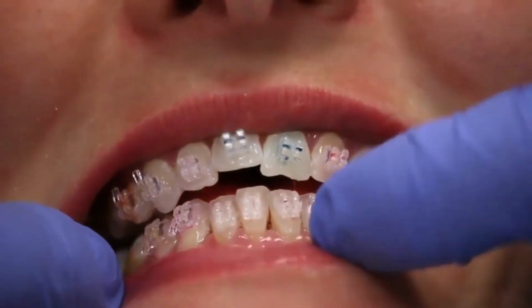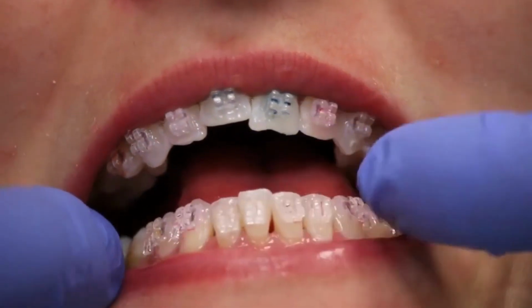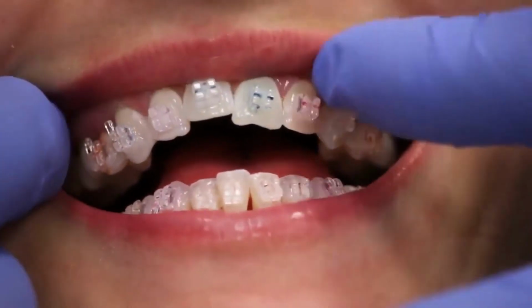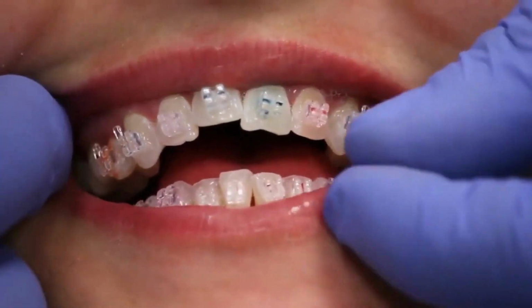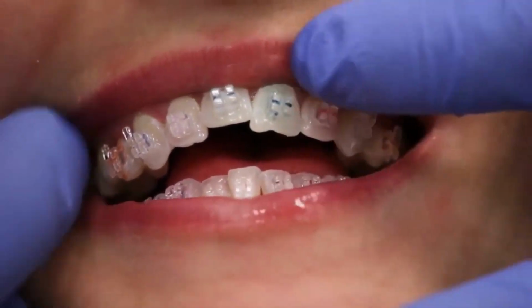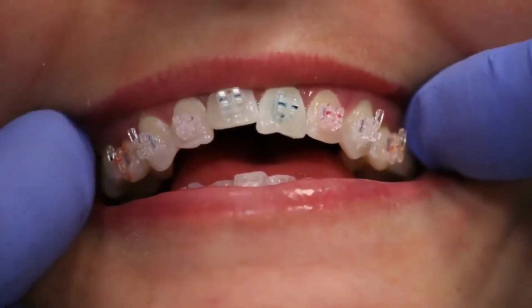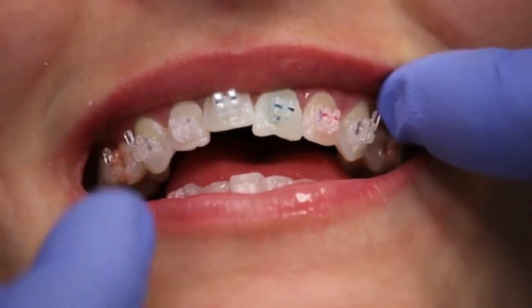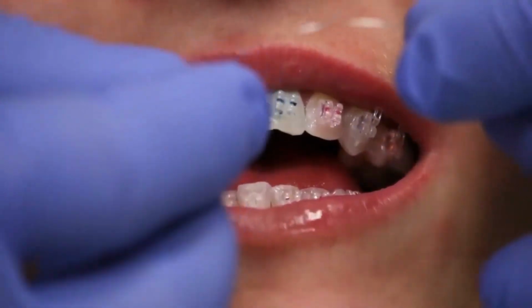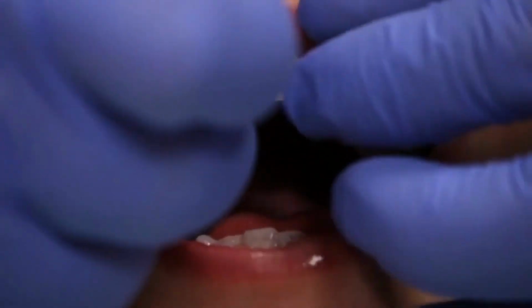As you can see, I clean up most of the color on the lower with a Profi cup, but when the patient rinses, it's going to look kind of like what you see on the top. And then if the patient just gets off the chair and brushes her teeth, if not the first time, the second time all the color will be gone. So we're going to place an 012 nickel titanium alignment arch wire.